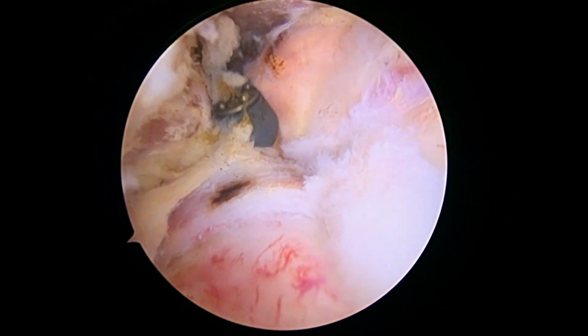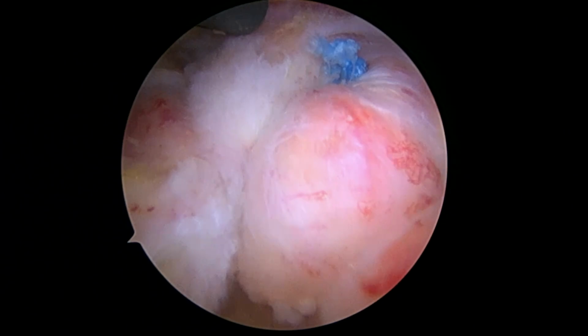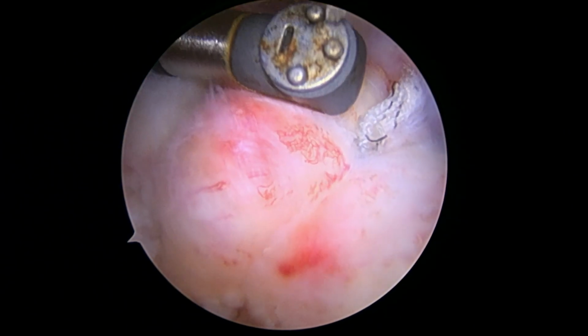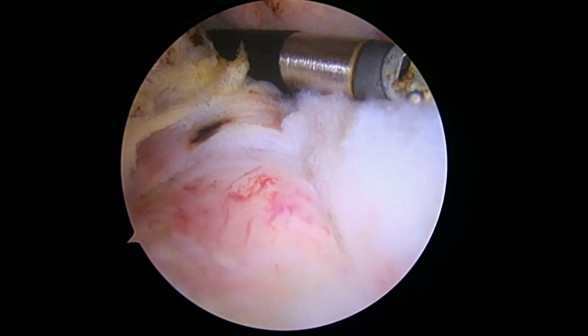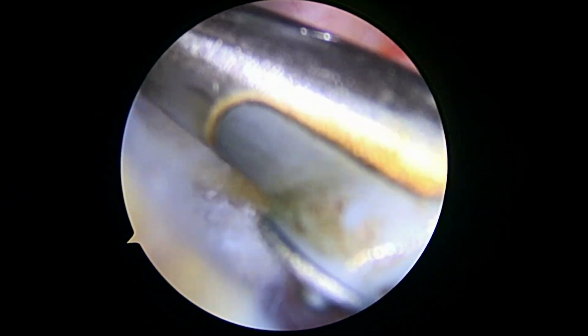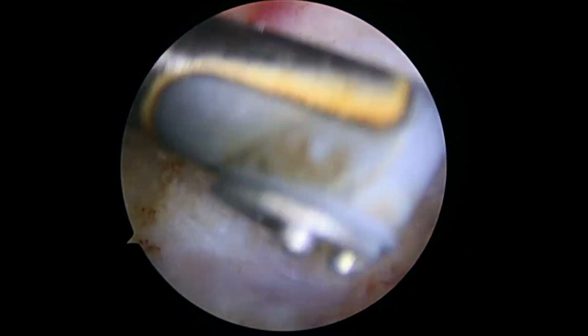Okay, so we're pretty much done. Let me show you what we've done here. We've tied all three sutures. This is the most anterior suture. This is the middle one. And remember that blue and white striped one was the first one, and it's right there. And already it looks a lot better to me. We've got this anchored down to the bone. And we've got one more little trick in our bag here.